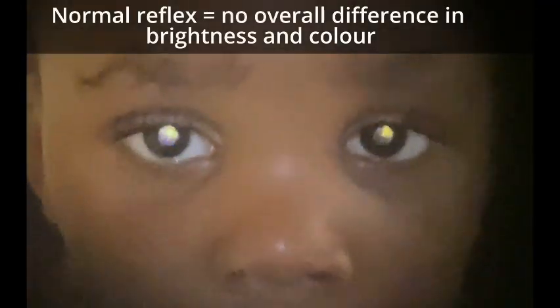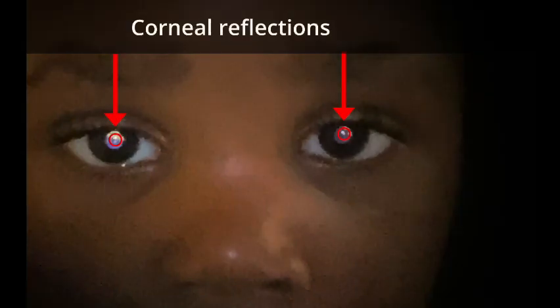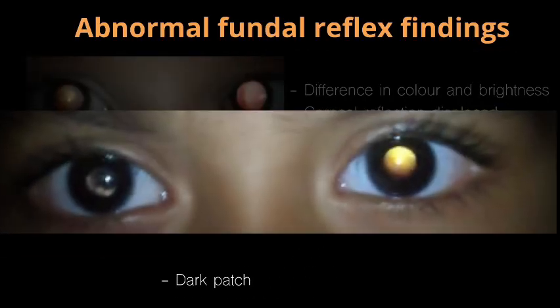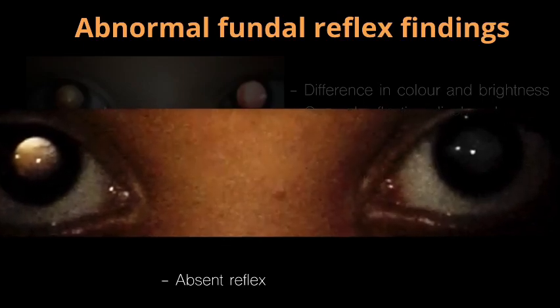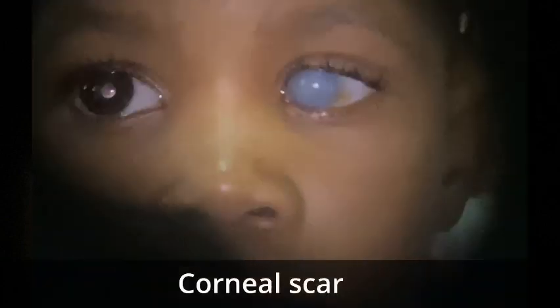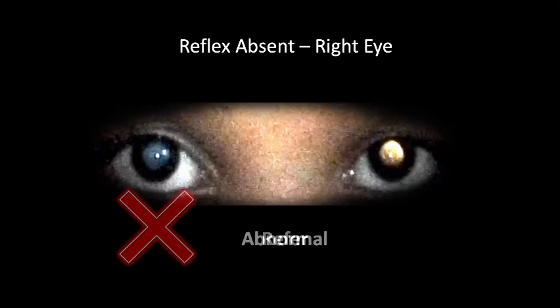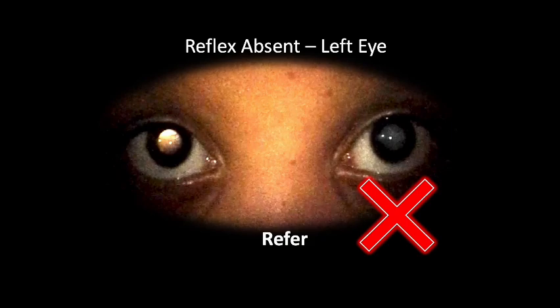Normal and abnormal reflex results are then shown, including the explanation of the corneal reflection test for the presence of squint. Video examples are shown of specific pathologies, such as cataract, retinoblastoma, corneal scar, squint, and refractive error. A comprehensive set of test examples with answers and actions are included at the end.